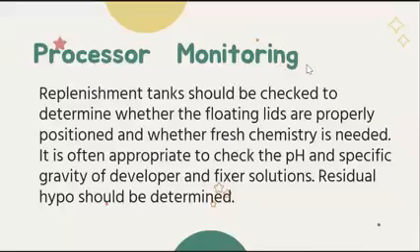Replenishment tanks should be checked to determine whether the floating lids are properly positioned to avoid aerial oxidation and whether fresh chemistry is needed. It is often appropriate to check the pH and specific gravity of the developer and fixer solutions, and residual hypo should be determined. So you have to check, no, the chemicals most specifically because the quality of the radiograph depends on the efficiency of your chemicals.